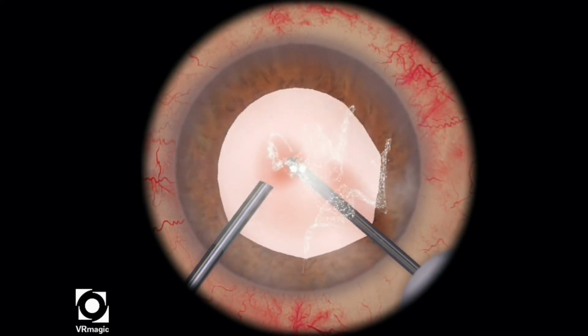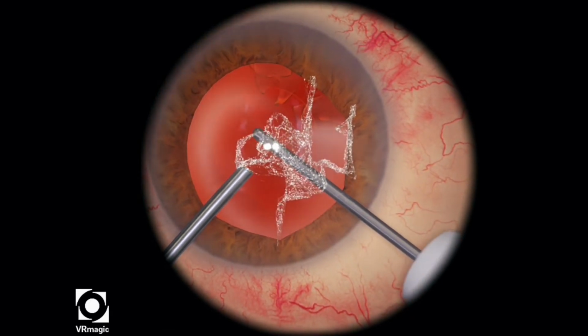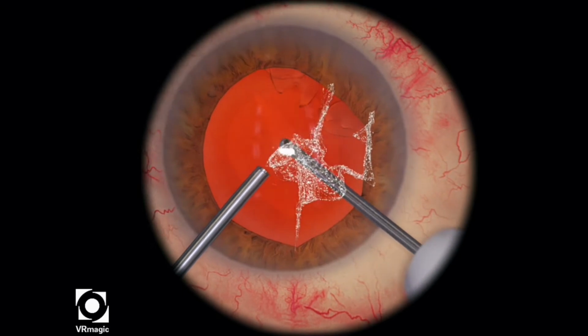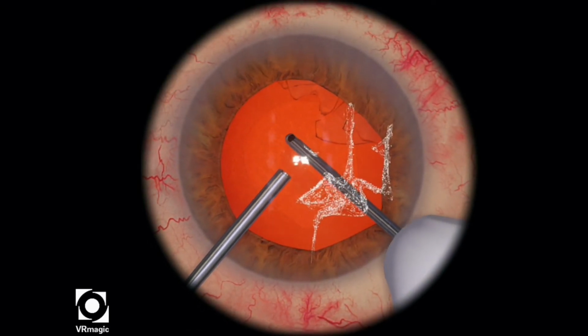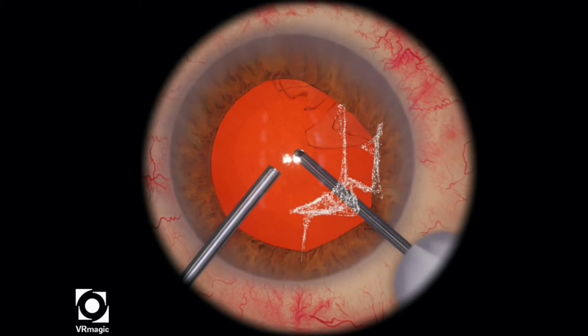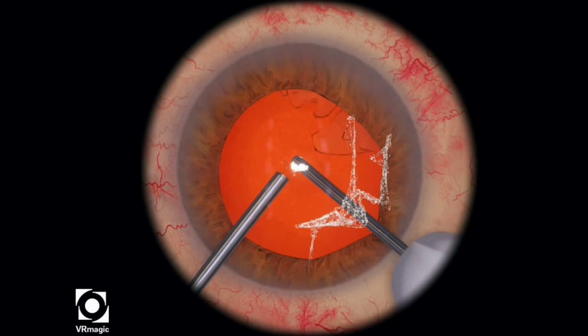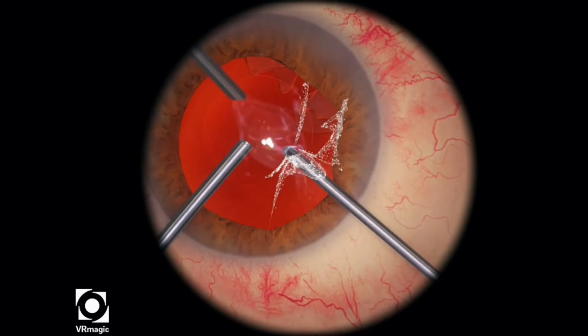So start off like you would with any of the other anterior vitrectomy levels, staying with the Triamcinolone, and then you want to start from back to front, making sure that you get most of the vitreous behind the posterior capsule so that you don't pull any of it forward, which would cause you to lose many points.